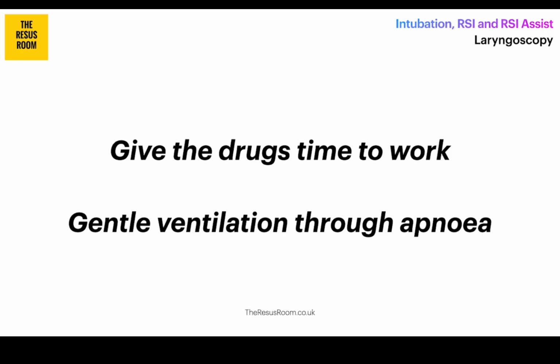But that changed, and mainly I think because of a paper in 2019 from Casey that moved things forwards. They saw that ventilation through apnea didn't cause the increase in aspiration rates that people were worried about, by ventilating through the apnea in a non-starved patient. Also, that these ventilations helped avoid critical hypoxia. So you'll provide these ventilations in apnea with a two-person technique, low volume, low pressure ventilations whilst they're apneic.